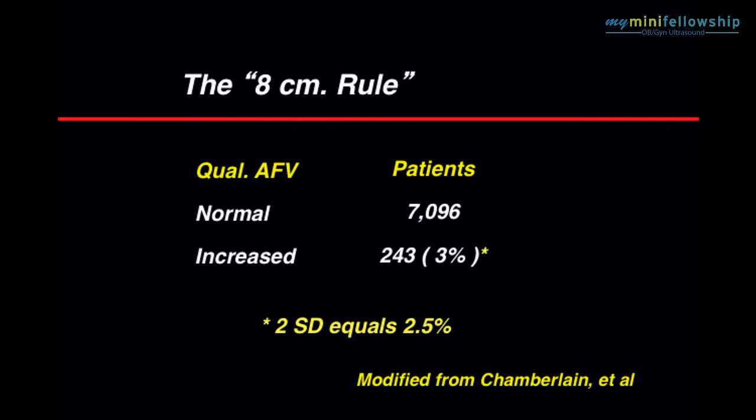Well, as I said, I thought that Dr. Manning had definitely gone off the deep end, and Dr. Ruth Goldstein and I decided we were going to prove that he was wrong and publish our results. So we were big believers in the visual estimate of amniotic fluid. So we did the following study.